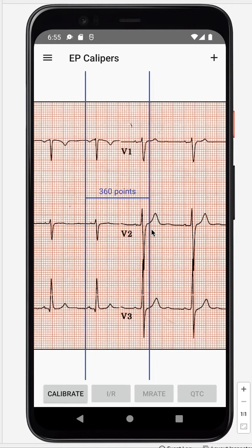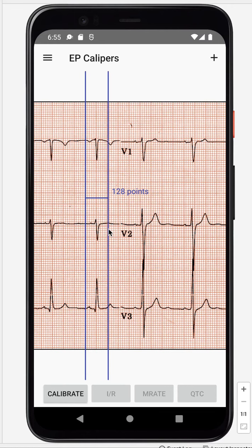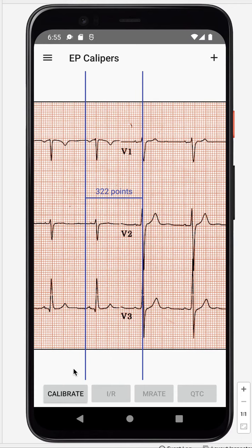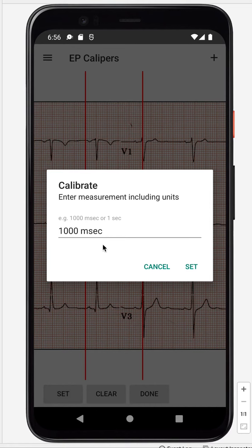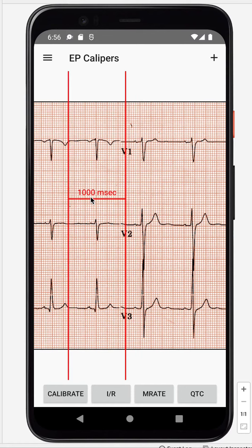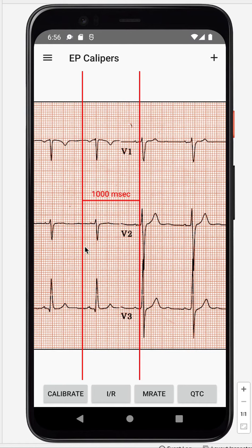We set it for a thousand milliseconds — two, four, six, eight, ten — about that. Hit Calibrate, hit Set, make sure this says a thousand milliseconds, and go ahead and hit that. Now we have an interval of a thousand milliseconds. Next, we want to record an R-to-R interval.